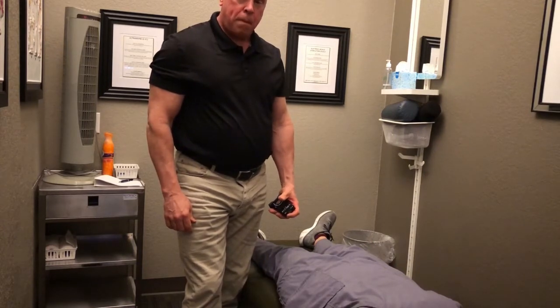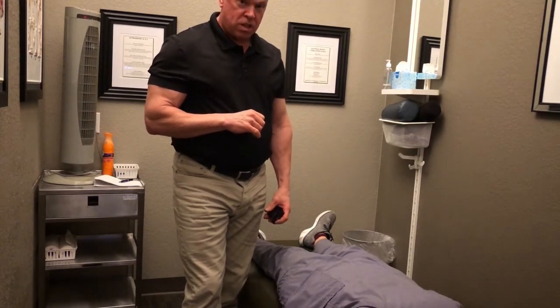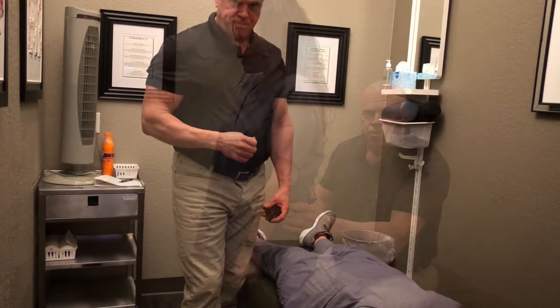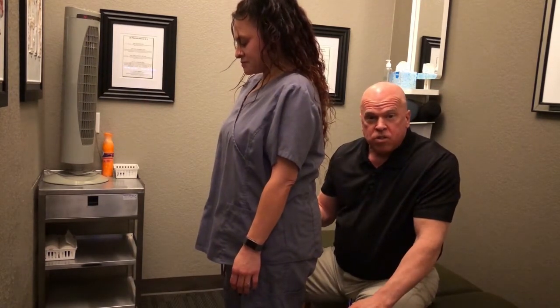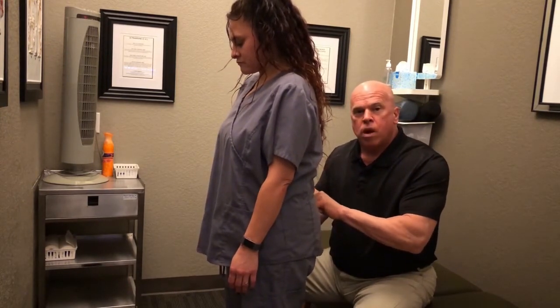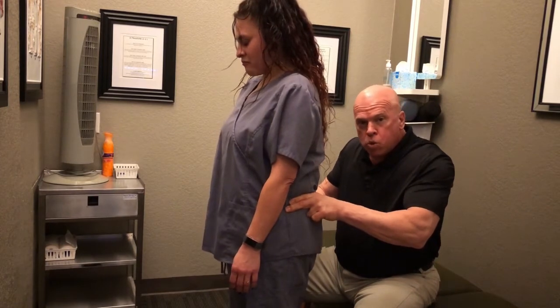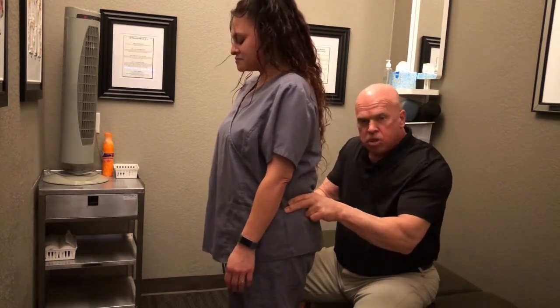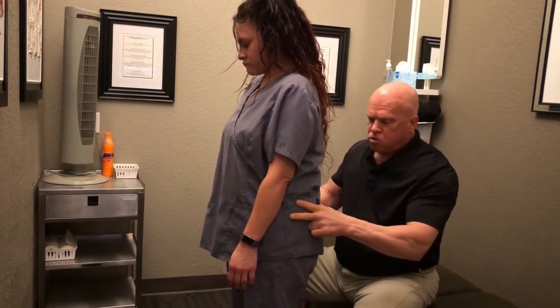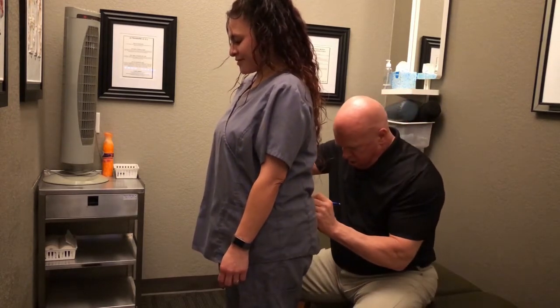Step 2 of the validity maneuver is to compare the finding of straight leg raise testing with the sum of sacral flexion and sacral extension measurements, which we will now demonstrate. Now, to measure the sacral flexion and sacral extension angles, you're going to place your inclinometer over the spinous process of the S1 vertebra. The S1 vertebra can be found at the center point between the 2 posterior superior iliac spines, which in this model are right here. Some models may be a little bit sensitive about you marking their spinous process, so you can just find that landmark by finding the center point between the 2 PSISs. And I'll mark it right here with a pen.